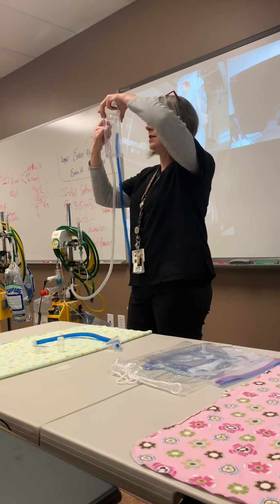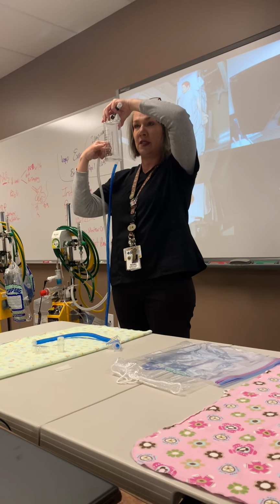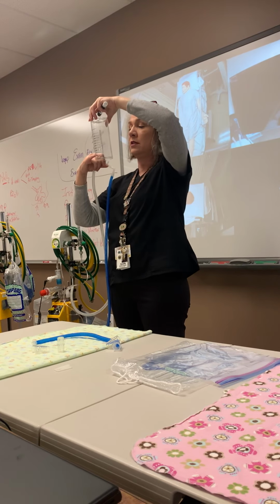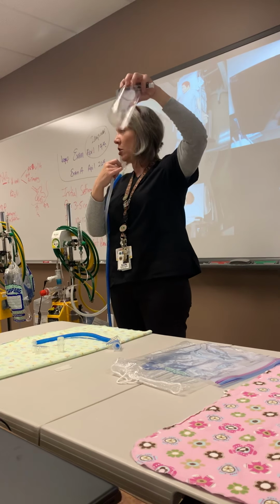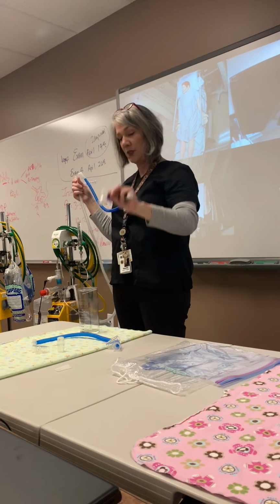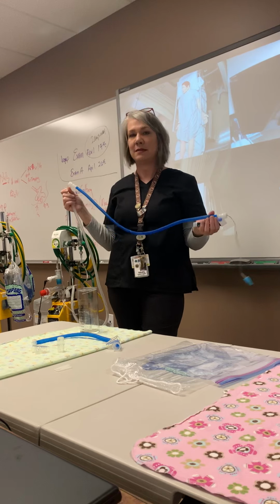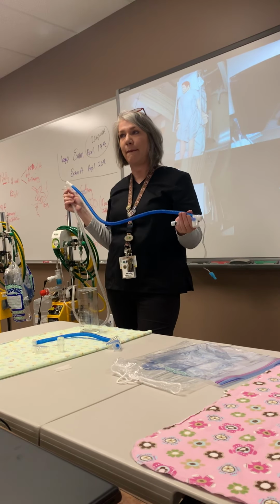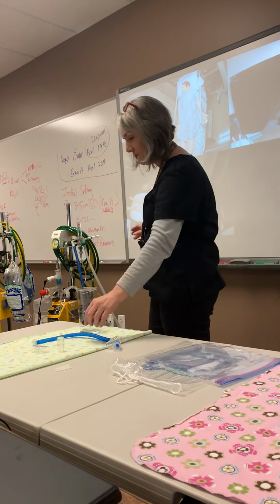The other difference between that and the Davis system is this one. Remember I said we fill to the 0 mark? Fill to the 0 and then instill the tubing down to the pressure desired level. With the UC Davis system, we fill to the line of pressure because there's a tube that goes down inside of their water column that gives us pressure. That's how you know which side of that column to put this on. It's the side with the tube. It also says inlet, and I'll show that to you too. Anybody else? Pause that for a minute, I'll go get it so we can have it on the video.